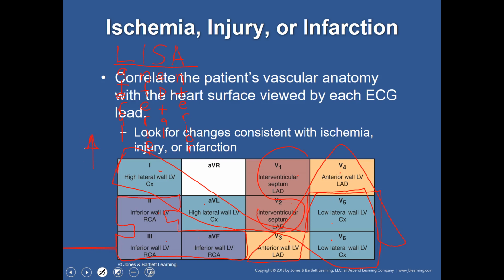You're right, if you guys said elevation or even depression, right? You could even be looking for depression. But we're looking for elevation, we're looking for EKG changes, okay? So when you go through, remember earlier we talked about 2 or more contiguous leads. You have to have those changes for that to be consistent. So in leads for an inferior, if you have elevation in lead 2 and in lead 3, that's 2 or more. That counts.